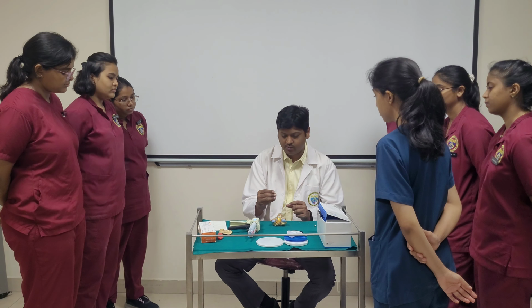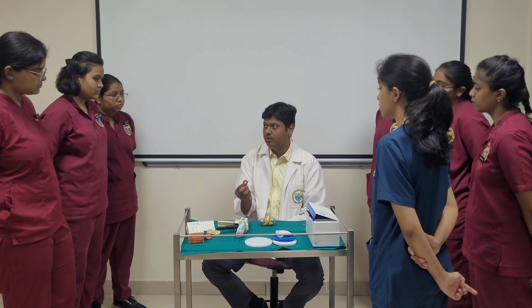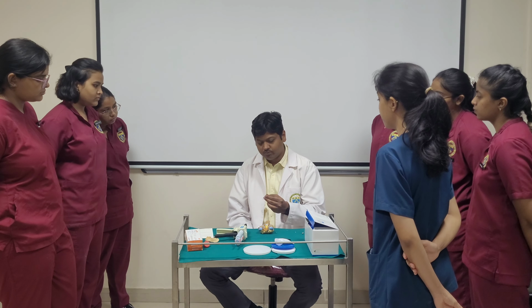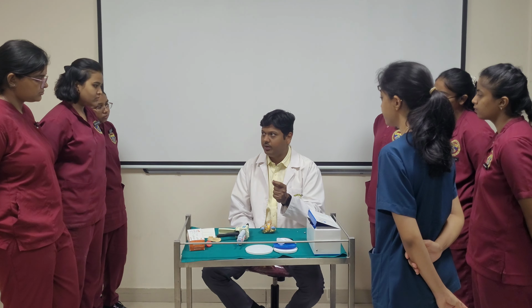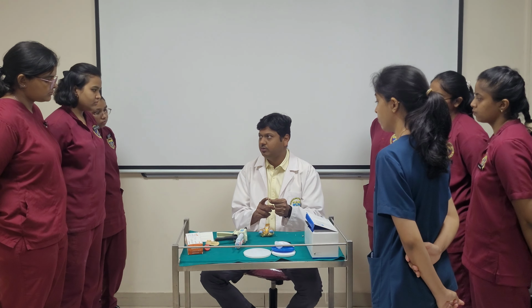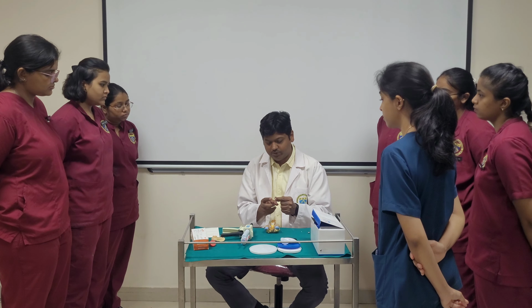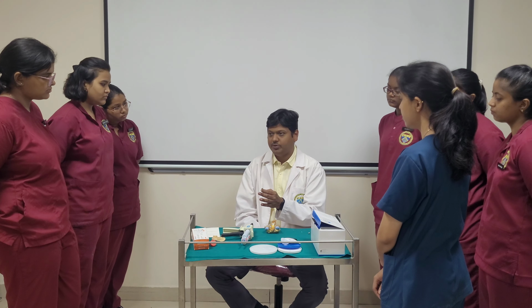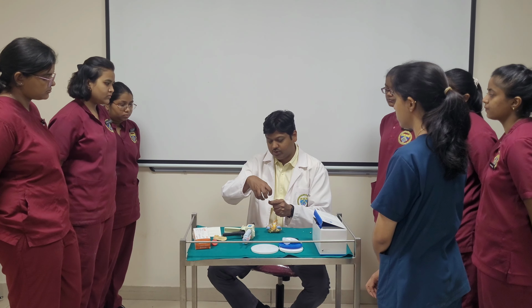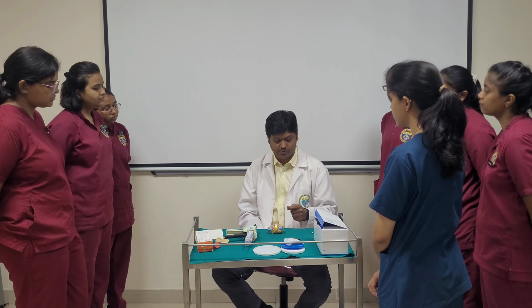This component is called a lab analog. This is just like your implant. You can call it a dummy implant or lab implant. The internal hex and the dimensions will be the same as your implant inside the patient's mouth. So, to mimic the implant, this will go inside the cast, inside the model. Over this you can fabricate a crown. So your patient's model will be the same as the patient's oral cavity. The same position of the implant will be transferred, and this will act as an implant. Over this we fabricate a crown, and that crown will be transferred to the patient's mouth and fixed.